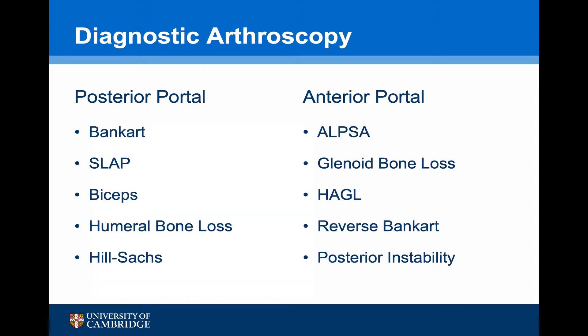As with any arthroscopic procedure, it begins with a diagnostic arthroscopy. Viewing from the posterior portal, it is possible to assess for the Bankart tear, evidence of a SLAP lesion, biceps pathology, humeral bone loss, and whether there's a Hill-Sachs lesion and whether that engages. The scope can then be placed into the anterior portal to assess the Bankart lesion more fully, note the presence of an ALPSA lesion, the amount of glenoid bone loss, whether there's a Hagl lesion, evidence of a reverse Bankart tear, or any evidence of posterior instability.